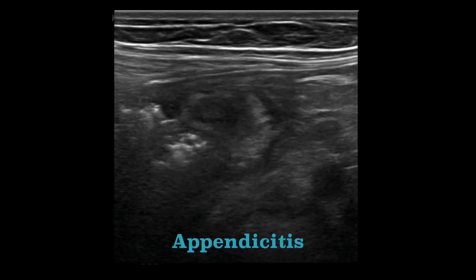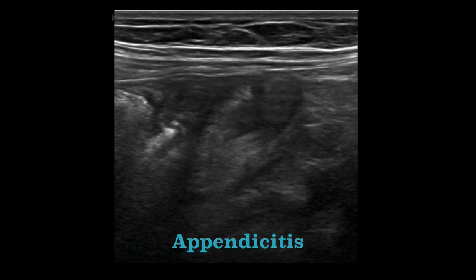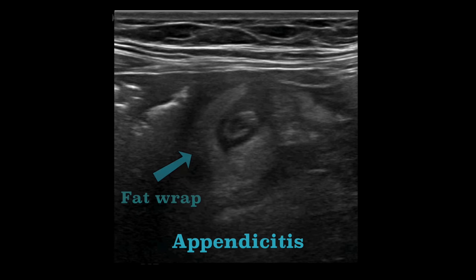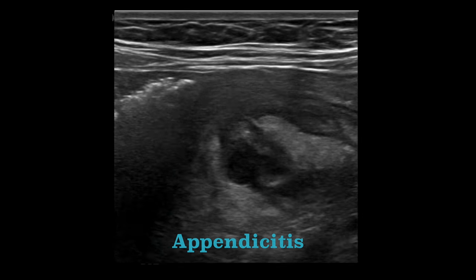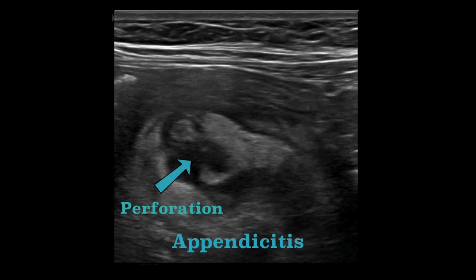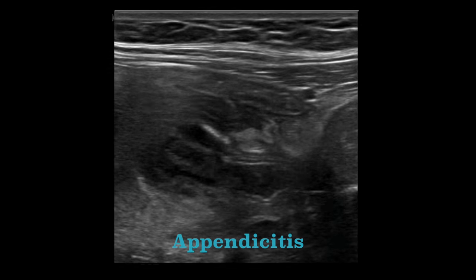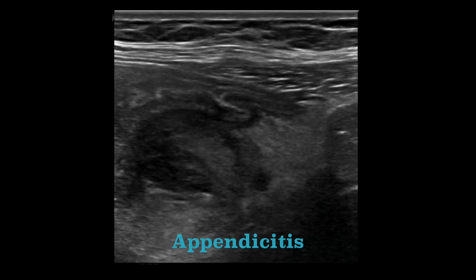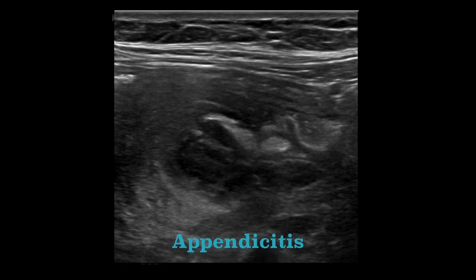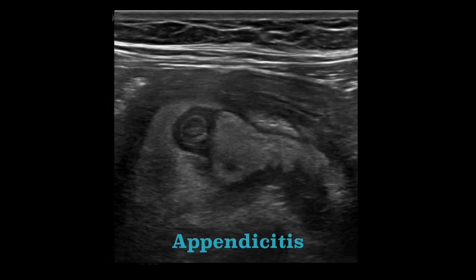Here's another example of appendicitis on ultrasound. Again, we have a dilated, thick-walled appendix. This time, there is a discernible fat wrap of inflammatory tissue. As we continue scanning, we see a defect in the wall of the appendix. There is also some surrounding peri-appendiceal fluid. These findings are suggestive of a perforated appendix.